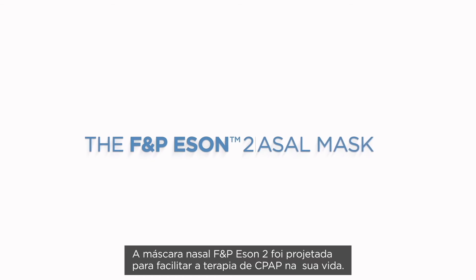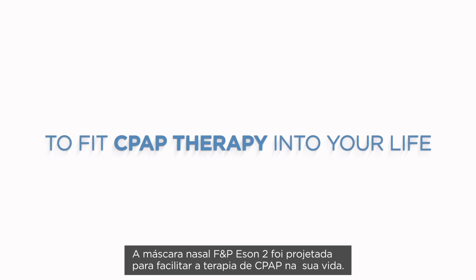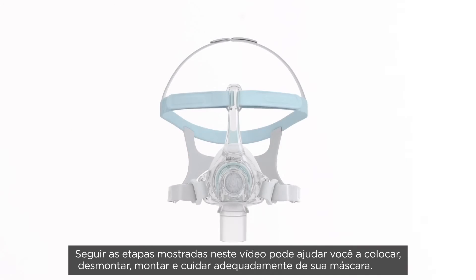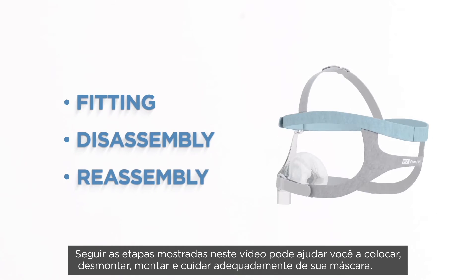Your mask is now ready for use again. The Fisher & Paykel Eson II Nasal Mask has been designed to make it easier for you to fit CPAP therapy into your life. Following the steps in this video can assist you with fitting, disassembly, and reassembly, and looking after your mask.